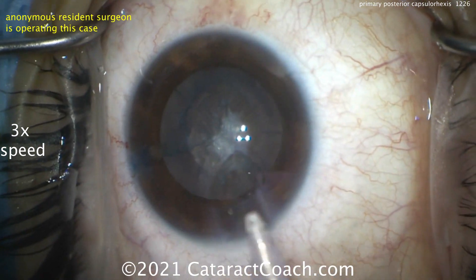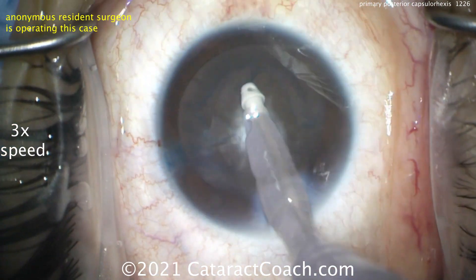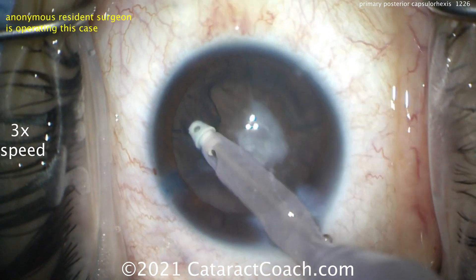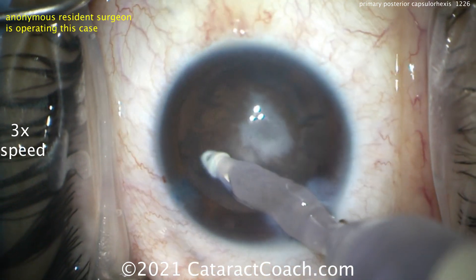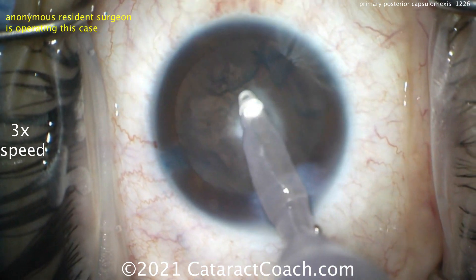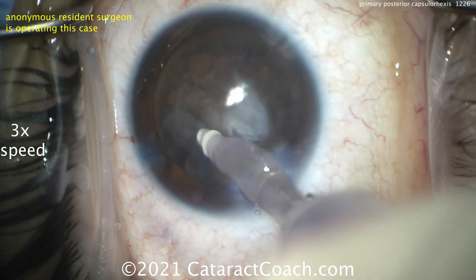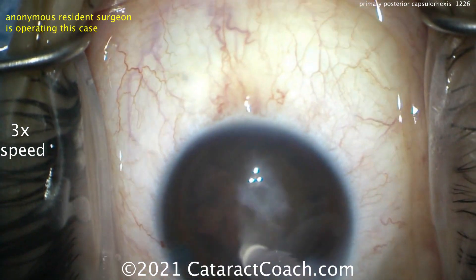There's going to be a posterior plaque here. Should we leave it alone? Could you just YAG it later? You could do a YAG capsulotomy later, but keep in mind I don't want to create a big opaque floater in this young patient's vision. A 29-year-old has a vitreous that's much thicker — almost solid — compared to someone 70, 80, 90 years old where it's very liquefied. So the anterior hyaloid face is going to be firm and want to stay together. I think we'll have an easy time doing our posterior capsulorexis while keeping the anterior hyaloid face intact.